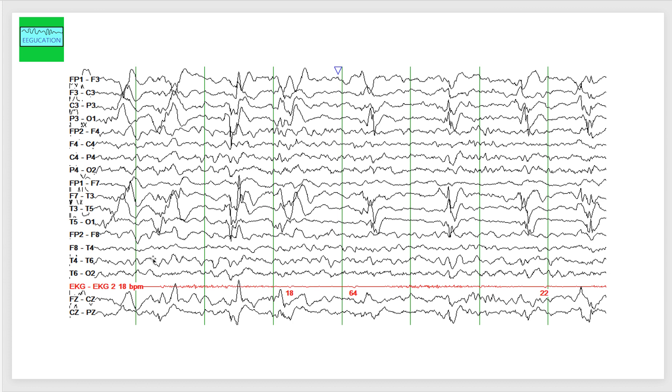You can see an asymmetry between the left and the right hemisphere. You see these sharp waves. These are not perfectly periodic, but tend to occur almost every one second.